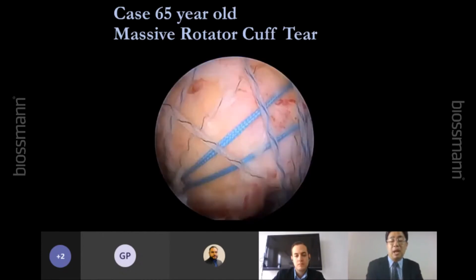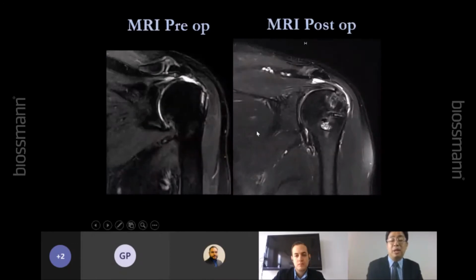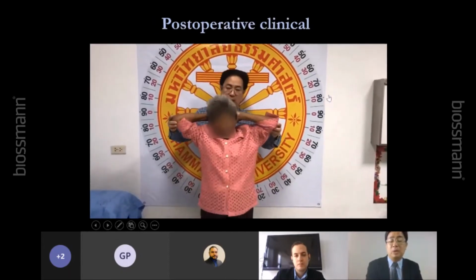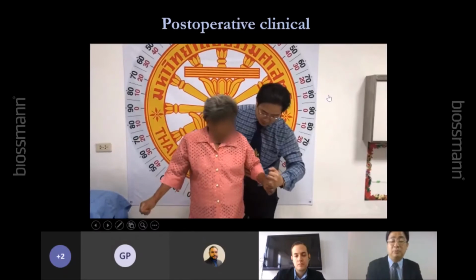Okay, and this is a suture bridge, my high bridge suture bridge technique, right? And this is the result. She has the very massive tear, but anyway, we can release and make a good result, good healing after the surgery. So this is about 2 years after the surgery. The patient has a better result and also a good functional outcome, right?